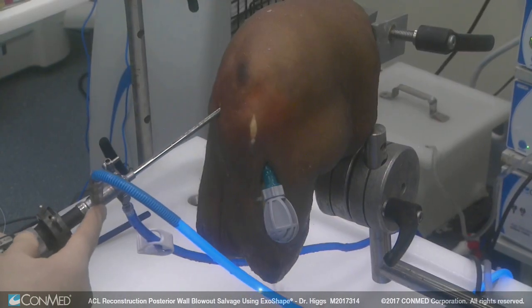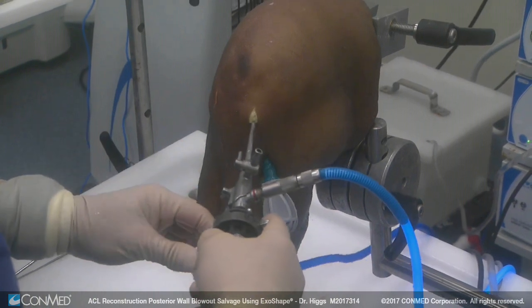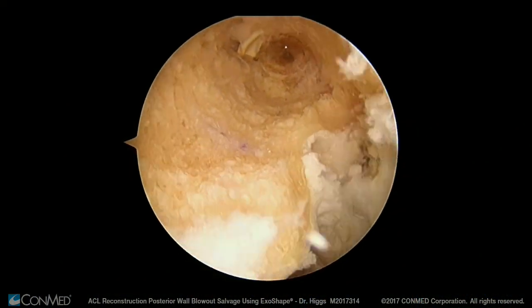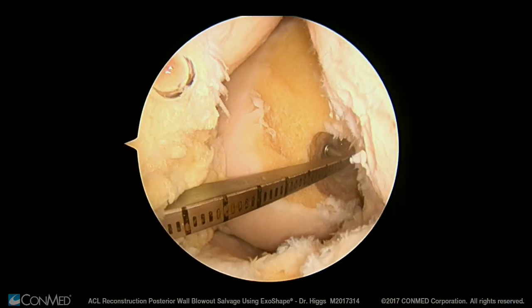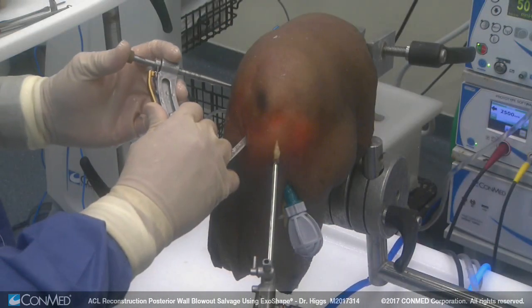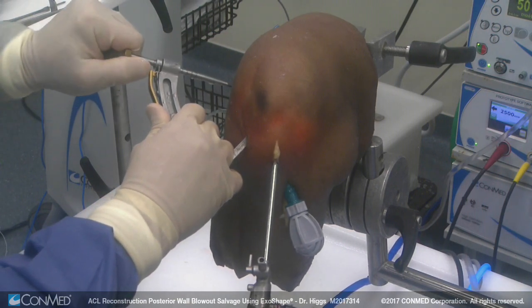The surgeon should switch the scope to the anterior medial portal. This allows visualization of the femoral tunnel. Then insert the tibial drill guide about 10 millimeters up into the tunnel. I want to come in from the lateral side of the knee, about a centimeter off of the articular cartilage cortical margin.